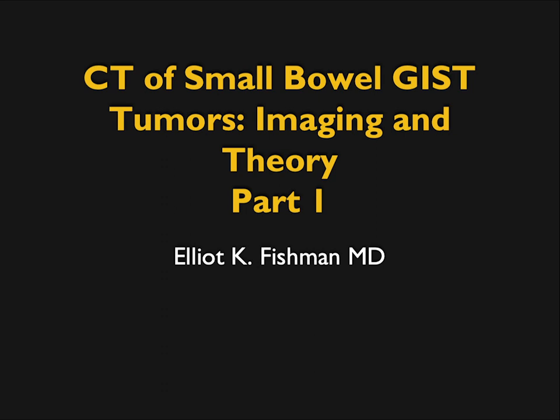And it's interesting, GIST tumors, and we've spoken about them, and I've shown them in some of my small bowel talks. We speak about GIST tumors in our stomach talk. We speak about GIST tumors when we speak about GI bleeding. And I realize, and there's been articles about this, that GIST tumors are becoming much more common, a 3 or 4-fold increase over the past 30 or 40 years. And so we see a lot of them in practice.